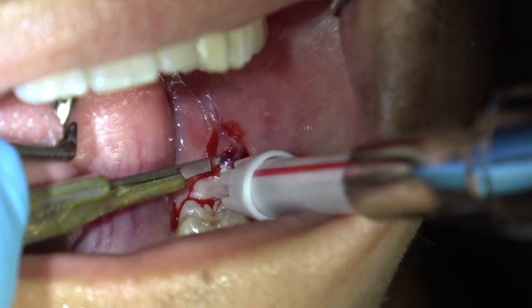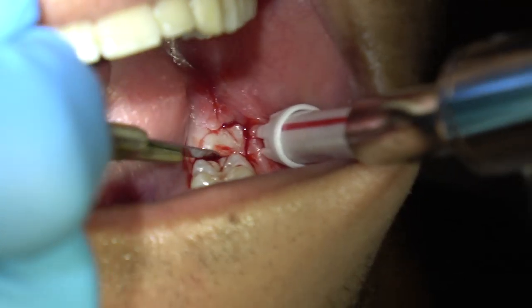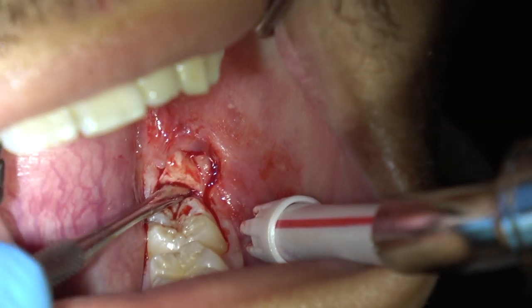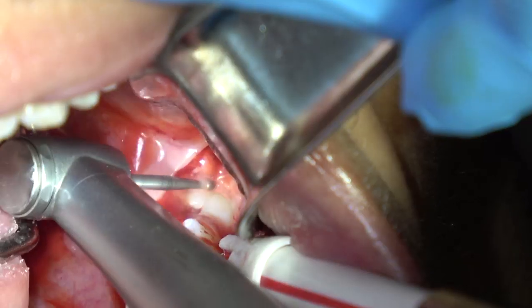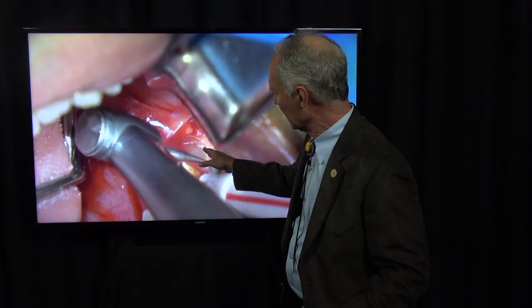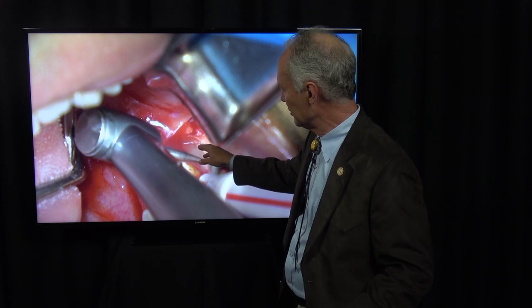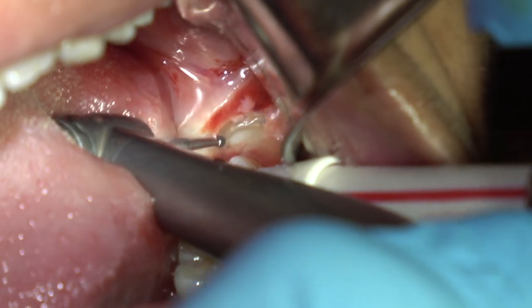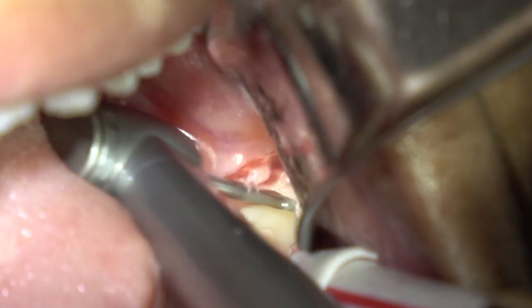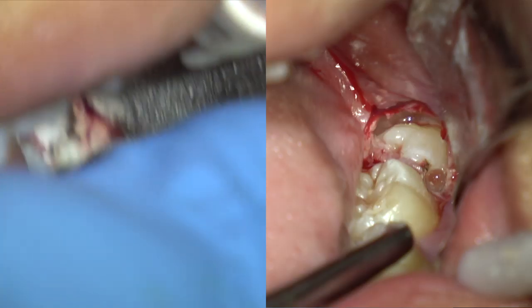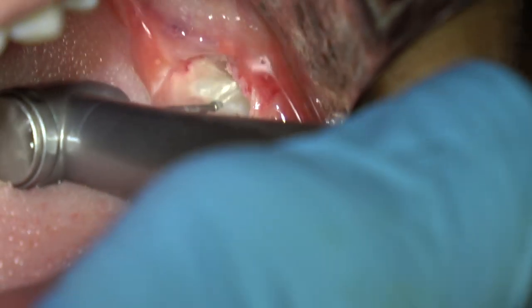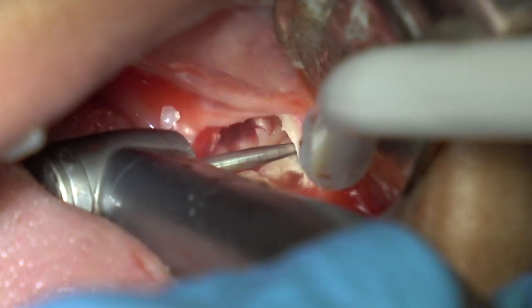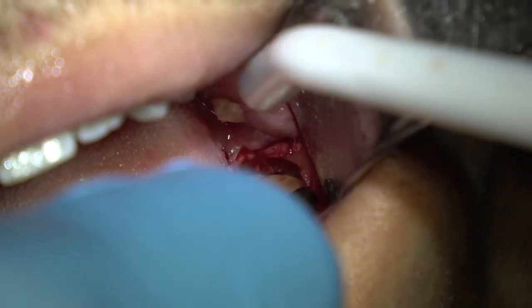Here's my facial incision. This incision comes to the distal lingual of that second molar, then an incision across the distal of the second molar, and I'm going to remove that piece with the periosteal elevator and rongiers. Now making a cut on the facial and the distal — be sure you don't extend it too far lingually because you want to protect that lingual nerve. I'm cutting primarily into the tooth, facial to lingual, from the occlusal to the furcation, then elevating that distal part.